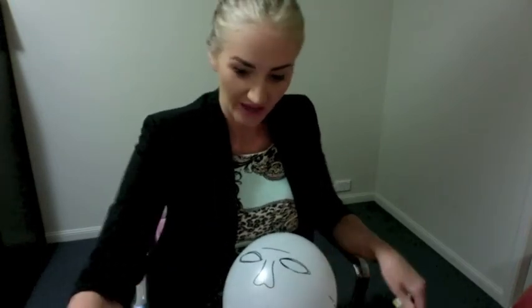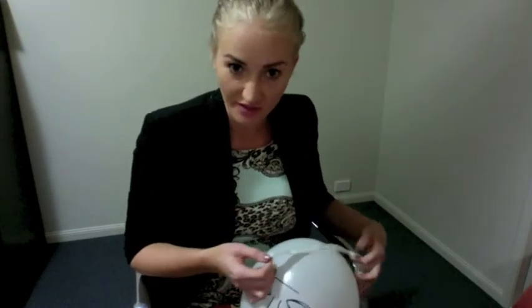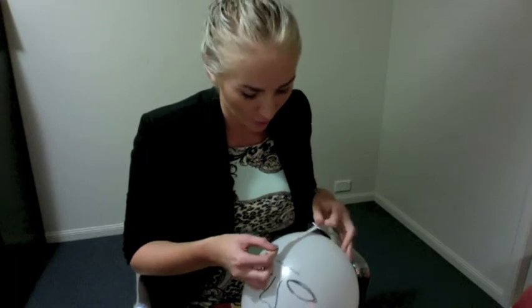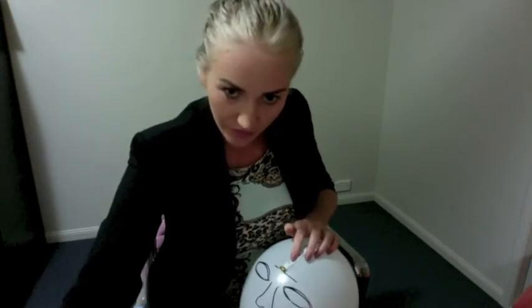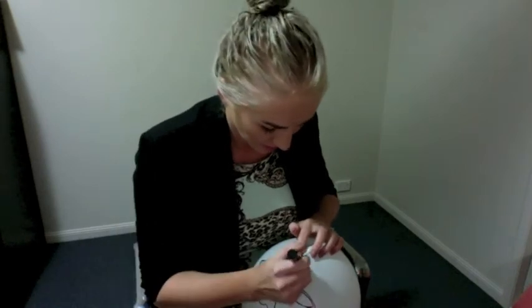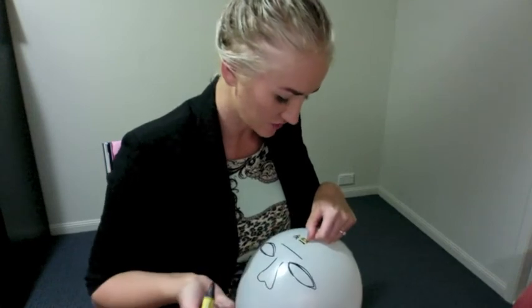Next, we will take 10% of the CZ measure, which was 30, so 10% is 3 centimetres. So we'll go 3 centimetres above the nasion, like so, and mark that. Take that as our frontopolar position and mark that.